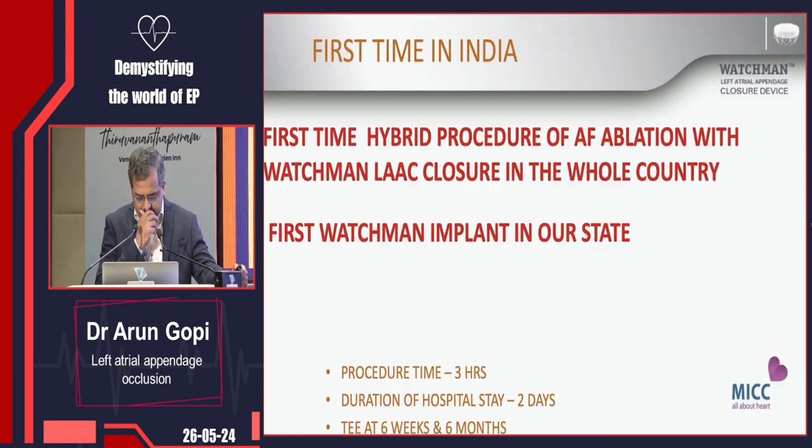It was gratifying for us because this hybrid procedure of AF ablation and Watchman closure was done for the first time some years back in the whole of the country. And this was in fact the first Watchman implant of our state. The procedure time was about 3 hours. The duration of hospital stay was 2 days.